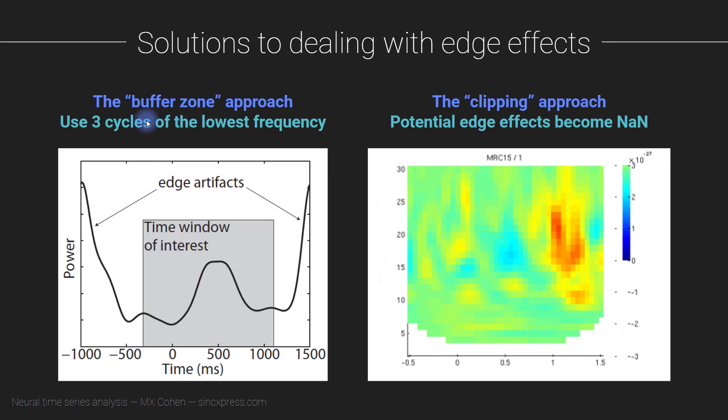So the first solution is what I call the buffer zone approach. So essentially what you want to do is make sure that you cut your epochs sufficiently long. You want your epochs, your time epochs, your trials to be cut sufficiently wide such that the edge effects will totally subside by the time you get to the time window that you are actually interested in.